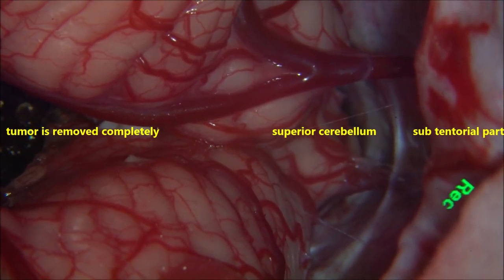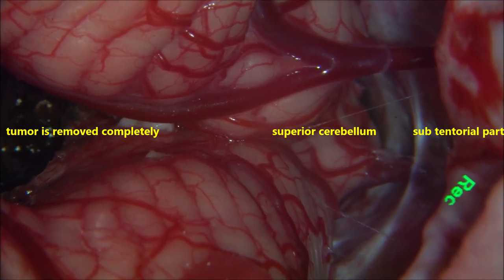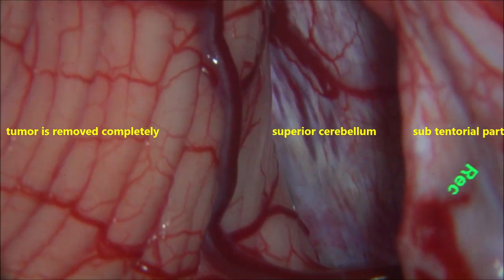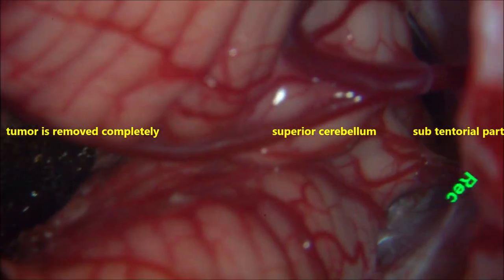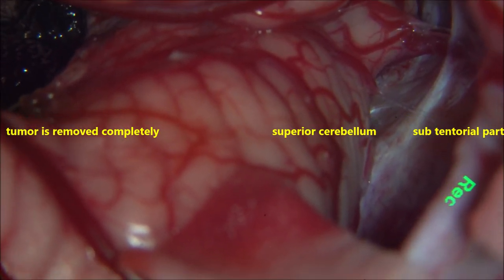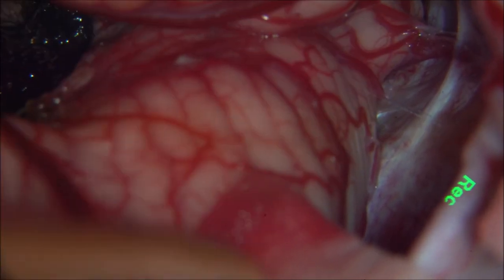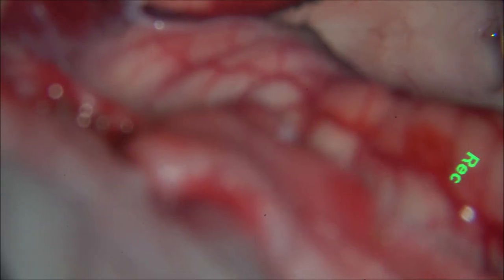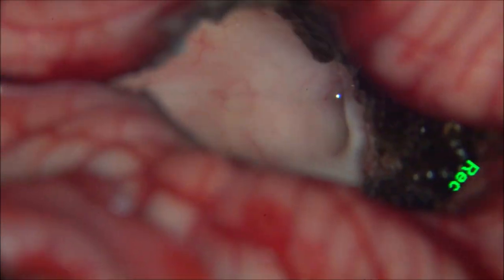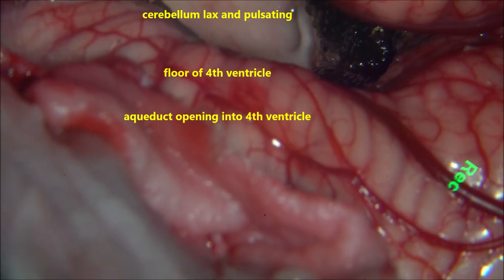This is the superior surface of the cerebellum. You can see the veins draining into the straight sinus, the central vein, and tentorial veins — that is the undersurface of the tentorium cerebelli — and the superior surface of the cerebellum. You can see the pineal region anteriorly. Once hemostasis is confirmed and BP has been raised by 10 to 12 mmHg with no bleeding, we can come out and stop the surgery.